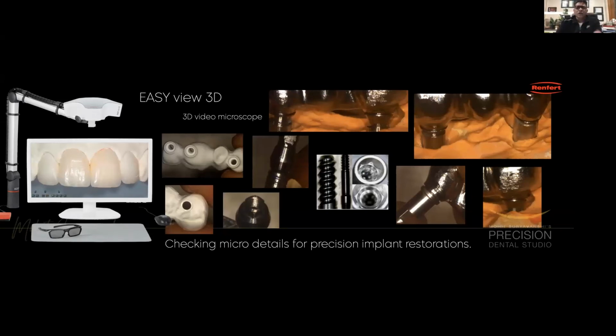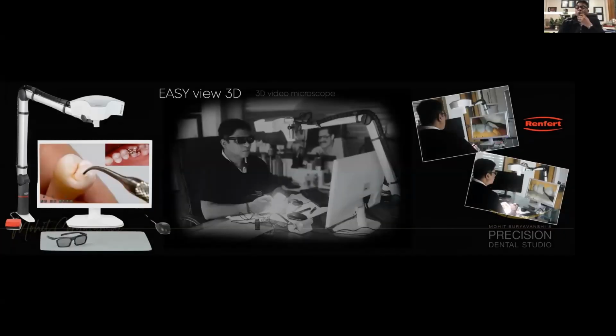If there is any shortcoming, see, there are a lot of shortcomings in the lab, and it's not only showing you the best things that we have over here. It's not like that. A practical guy knows there's so many things happening wrong, and to inspect all that, you need to have a very, very clear vision. And this is what assists me really well. It's just handy, click it on and you get to see it 20 times bigger right on your screen. Okay, so this is a fantastic gadget, has simplified my life so much.